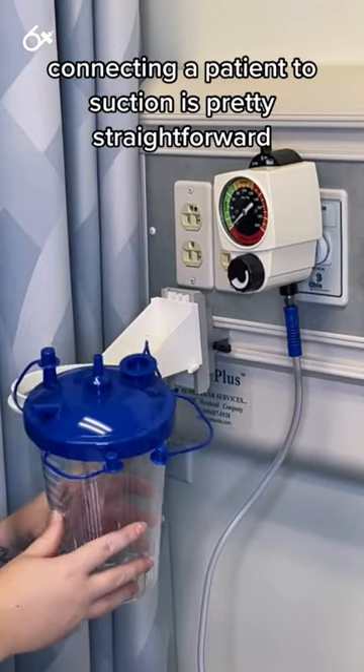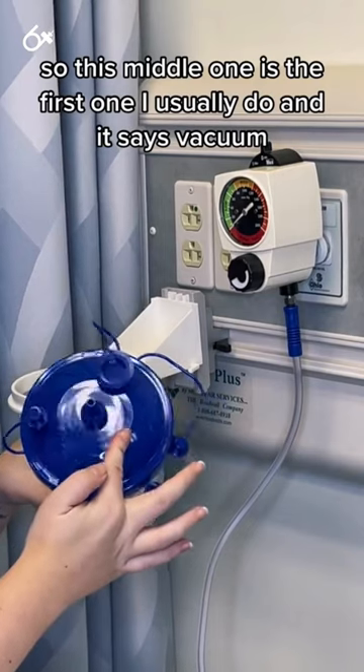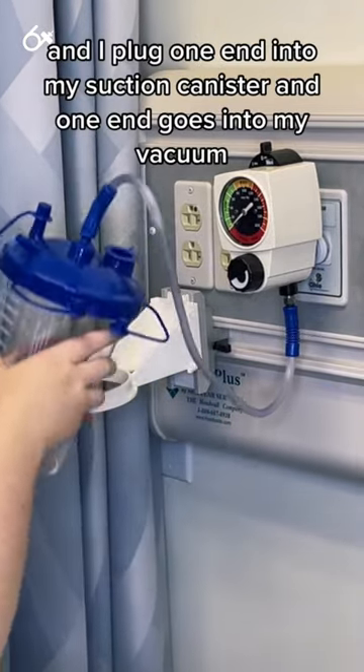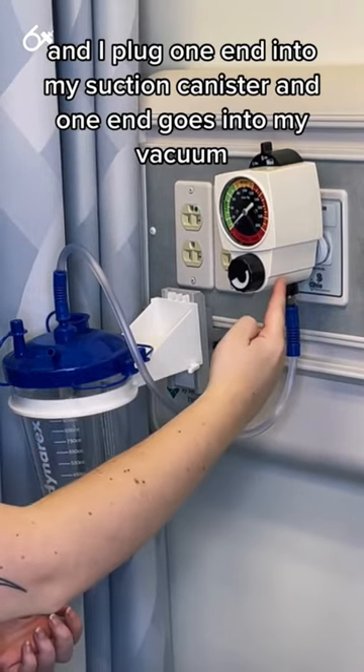Connecting a patient to suction is pretty straightforward. Each of these ports are labeled. This middle one is the first I usually do and it says vacuum. I use a fairly short tube and plug one end into my suction canister and one end goes into my vacuum.